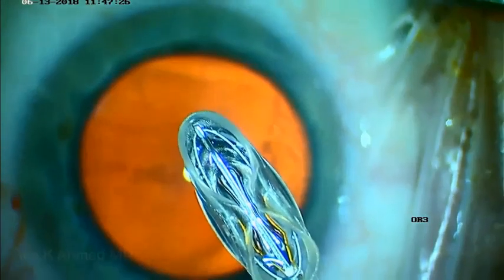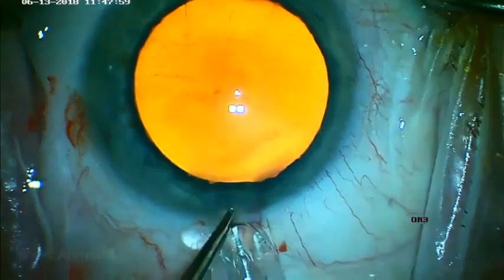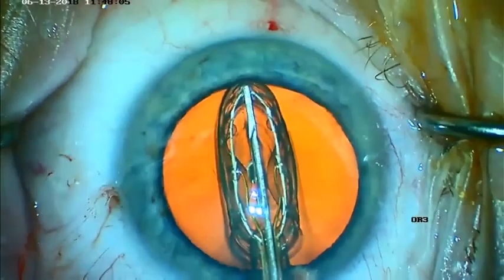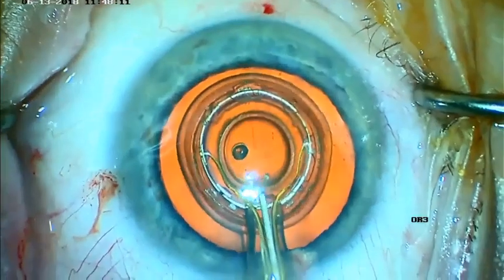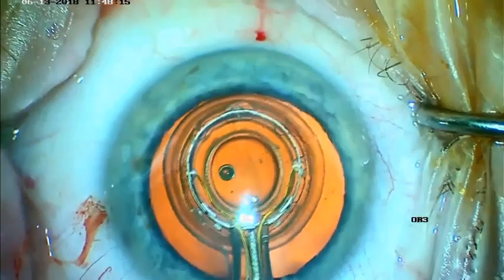Before insertion, we make sure the push rod is engaged properly with no abnormalities and no debris present. We then slide the device into the anterior chamber through the 2.2 millimeter incision fairly easily using a pair of forceps. We pull the push rod back using the slider on top of the device; the push rod remains in the shaft just past the silicone skirt.